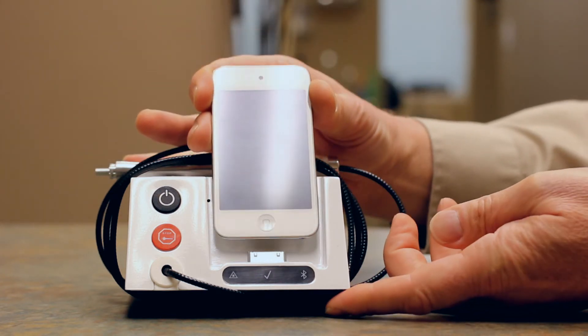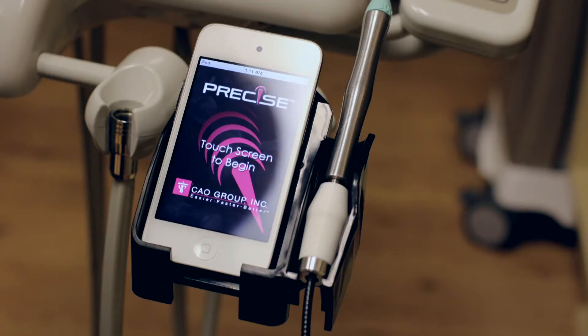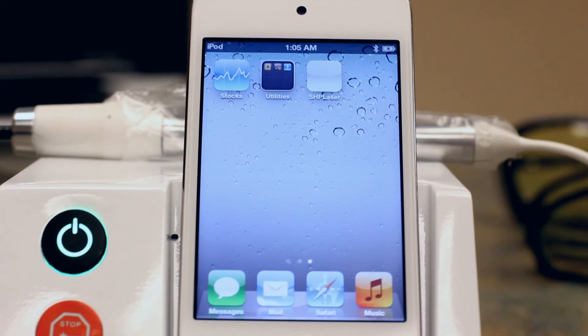This iPod has all the functionality and capability of any ordinary iPod that you may buy from an electronics retailer. CAO Group provides the iPod with the SHP kit so you can be assured the system will work safely and correctly. CAO Group cannot possibly test for or anticipate every program, app, or download that exists now or may be developed in the future. Thus, there is uncertainty about how other programs or files could affect the performance of the SHP system. CAO Group encourages you to refrain from loading other content on the iPod. Always test-fire the laser before using it on a patient to ensure the system is working correctly.